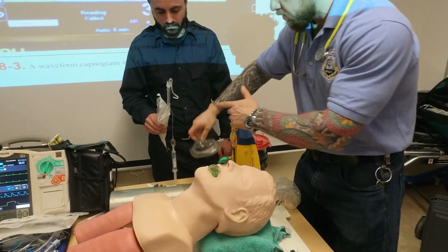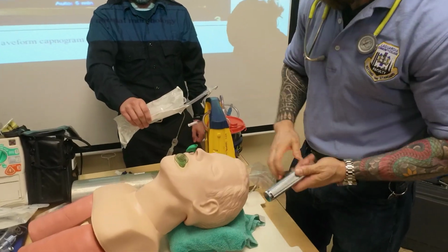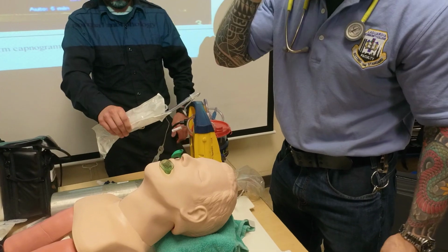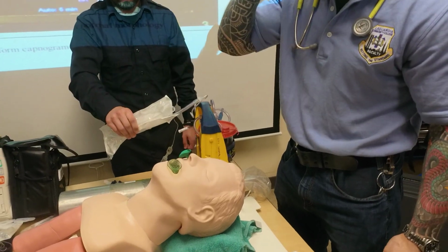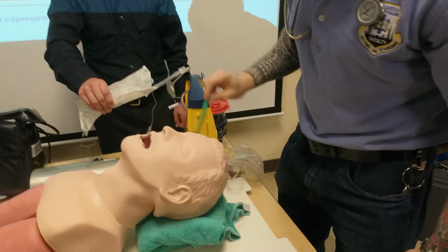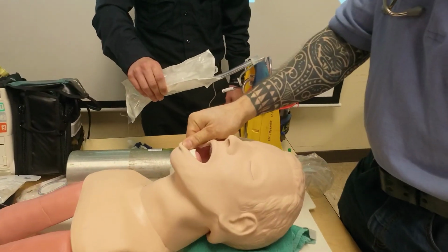I say, Will, you got my tube ready? Hold this next to me like this. I get my blade out, and then I tell my partner, let me know when it's 92, but I'm also listening. So I take this out anatomically. I'm going to use the technique to open the mouth.